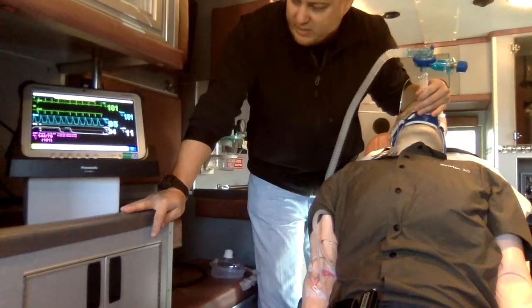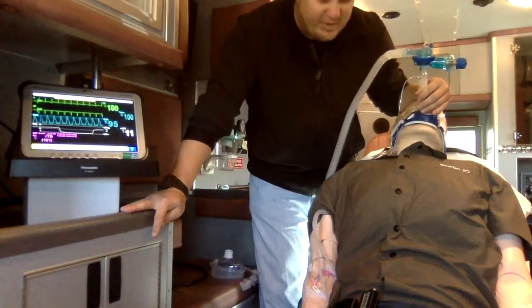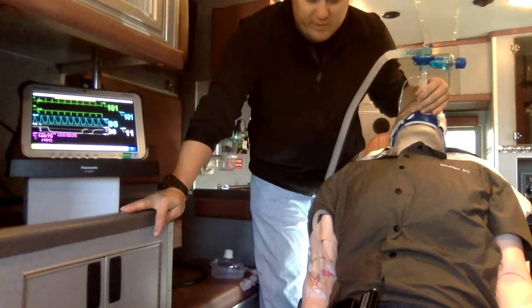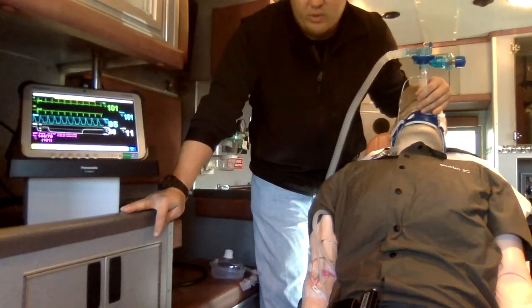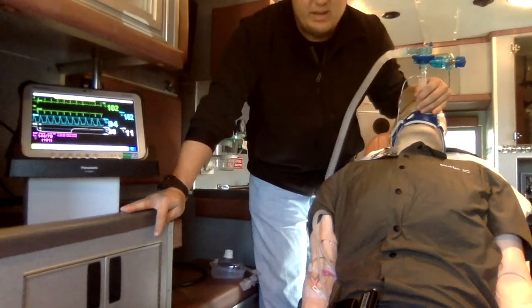Paralytics and sedation medication are all appropriate, and this patient would get transported to the hospital in a semi-Fowler to high Fowler's position, secured with hopefully a 5-point harness, and reevaluated every 3 to 5 minutes to make sure I don't have any change in end tidal, which would make me suspect that I'm losing my tube.